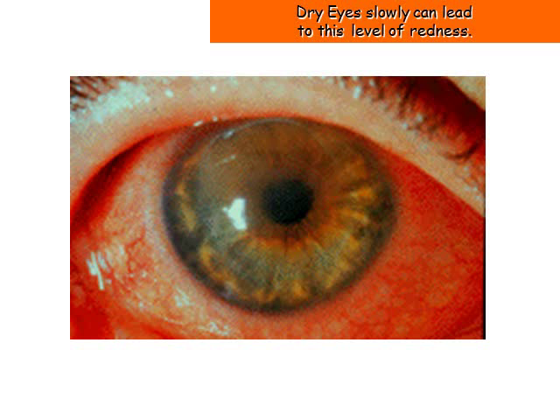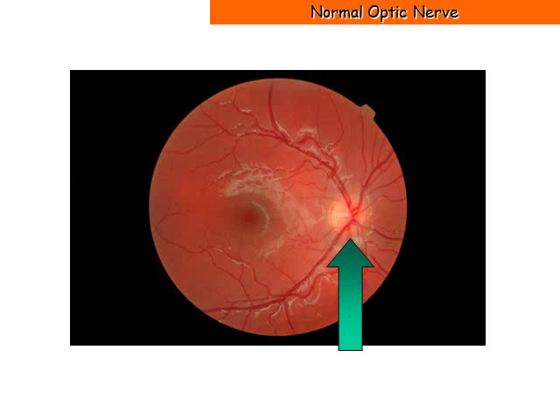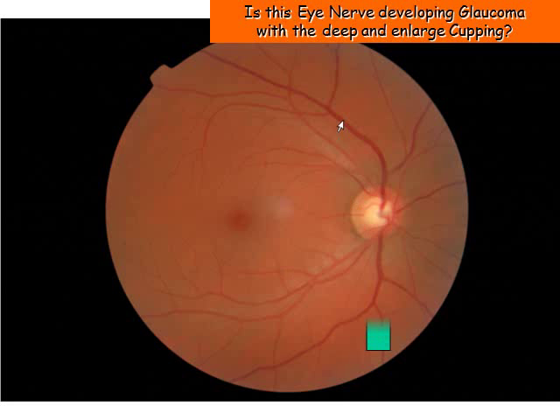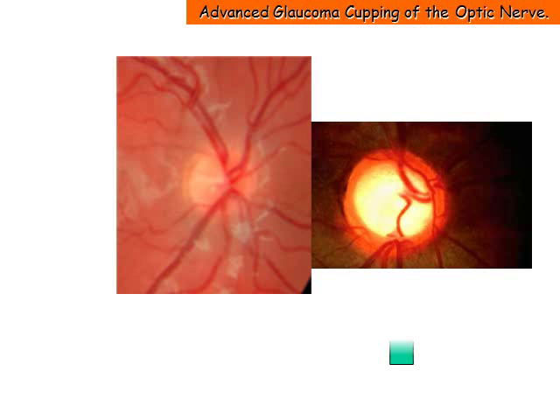As you can see, dry eyes slowly can lead to this level of redness. This is a normal view of the inside of one's eye. The eye nerve is the white round area. Is this eye nerve developing glaucoma with the deep and enlarged cupping?